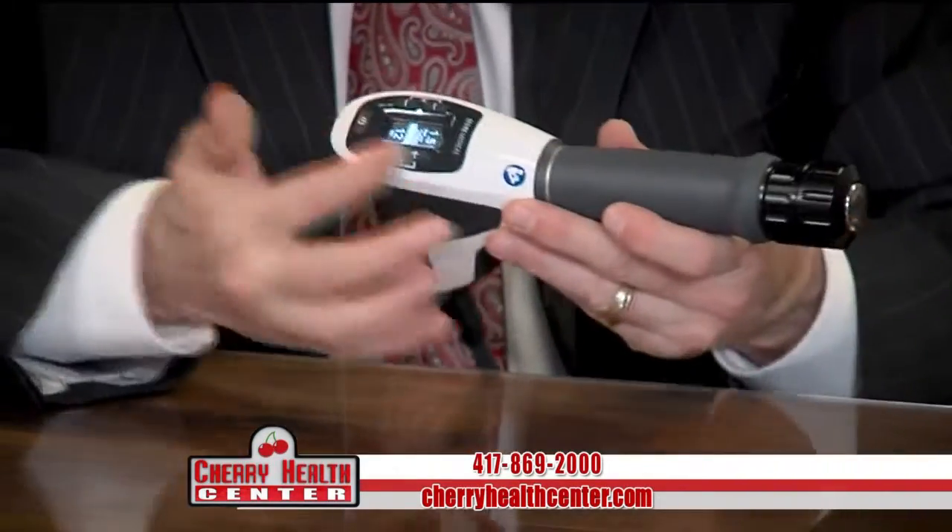What is this? This is a pressure wave machine. It is designed to emit waves — sonic waves of pressure, using sound waves.